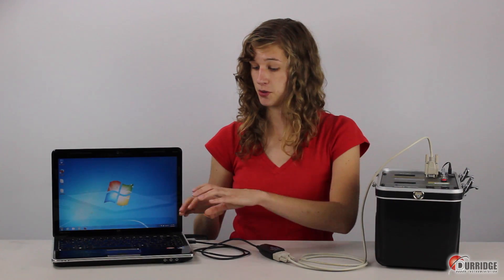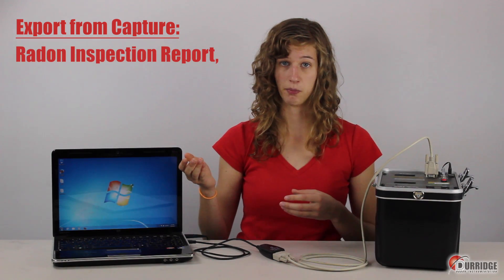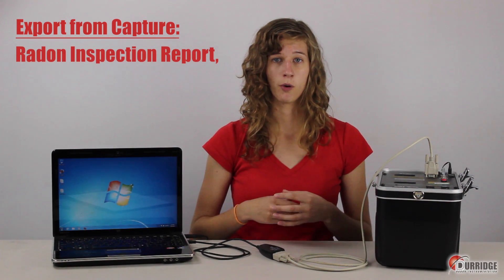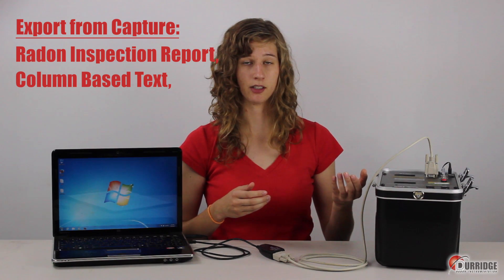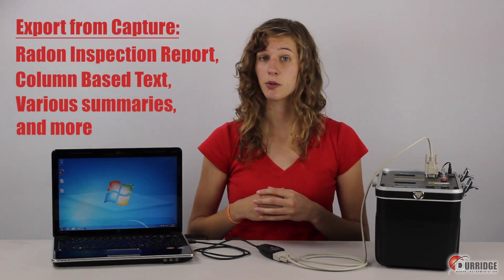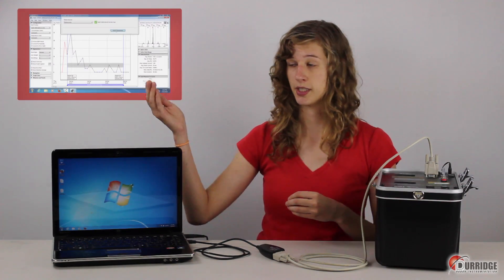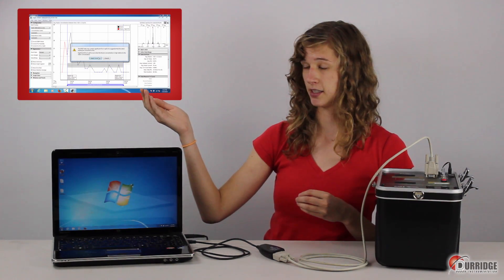You completed an analysis of your RAD7 data using Durridge's capture software. The data is now stored on your computer's hard drive, so you can access it at any time. Durridge's software also enables you to complete additional analysis, including exporting the data in different formats. For example, an official Radon inspection report, or a format that can be imported into Microsoft Excel, and more. To learn more about Capture's capabilities, you can watch Durridge's video tutorial using Capture 2 Advanced Analysis, or consult the Capture User Manual.